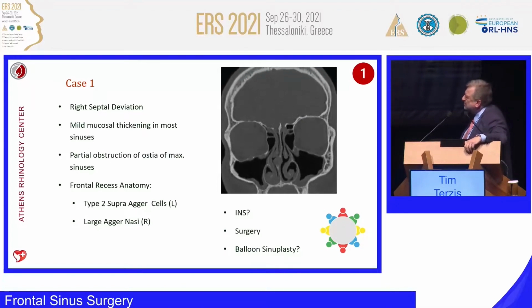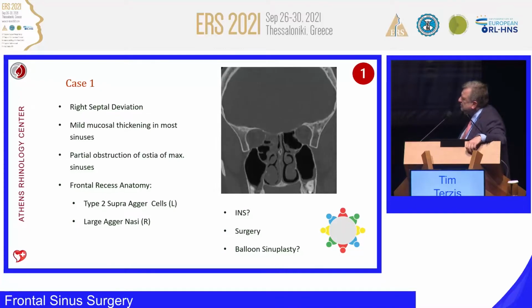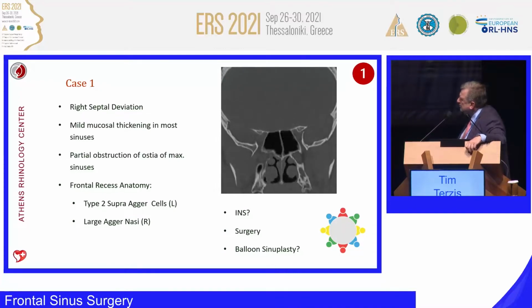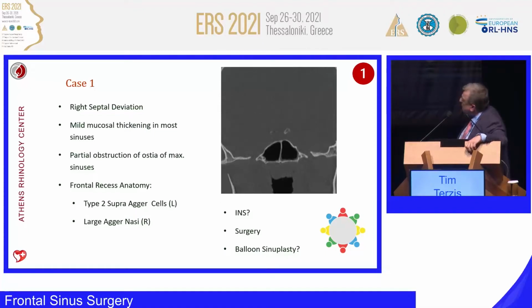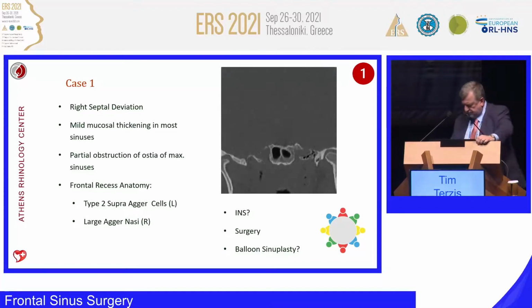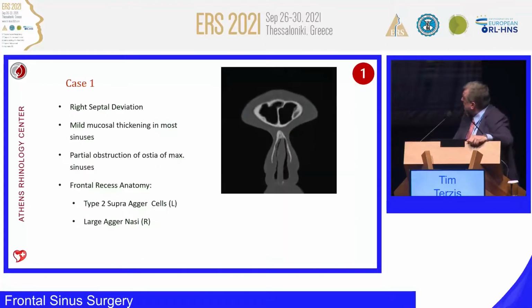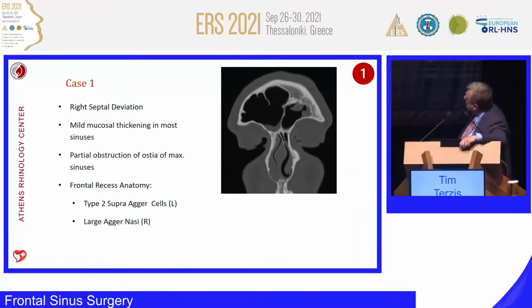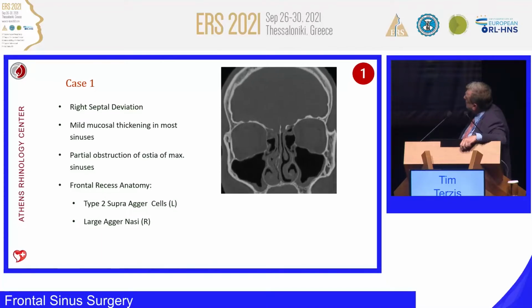It's a nice case. I would like to know about the CT scan. How old are the scans? Are there more than one scan available? So, do you have maybe an MRI as well? Sorry. That's the pictures I have here. And we have this film here of the coronal. Maybe you can see a bit more.